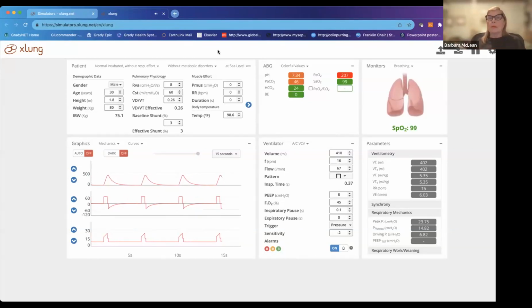So last week, we talked a lot about PEEP and mean airway pressure, and also just recognizing drive pressure, normal drive pressure, which should be less than 15. Now look at us now. We have a beautiful drive pressure at 6.82. Should always be less than 15. That's plateau minus PEEP. Some people like it, other people don't like it. The problem is when you measure a plateau or you measure a peak pressure, if you are not compensating in the number for the amount of PEEP you're giving, then you are falsely looking at your patient. So really important. Our patient looks pretty good right now.